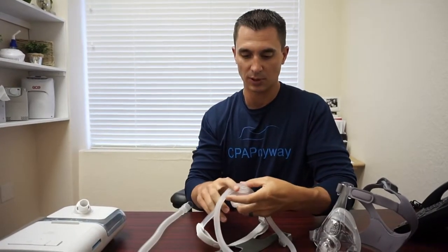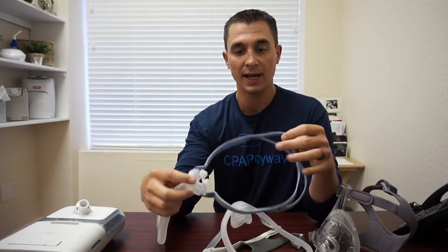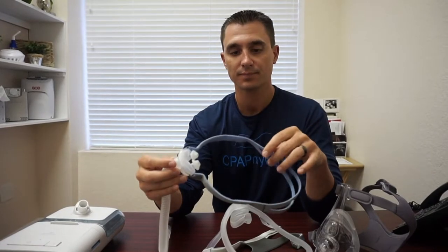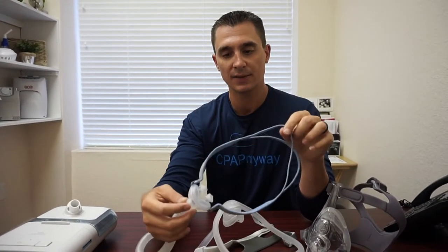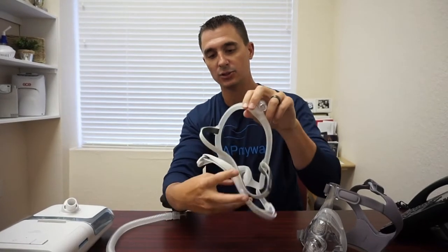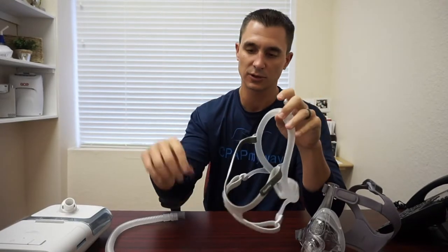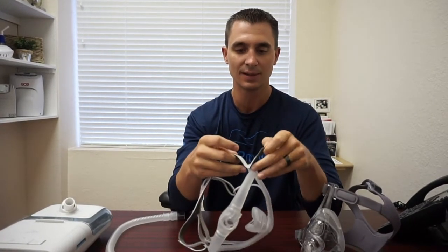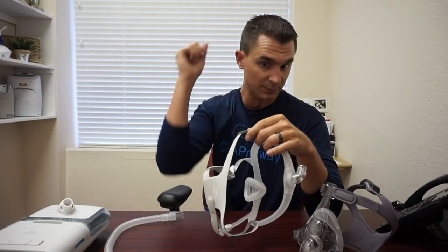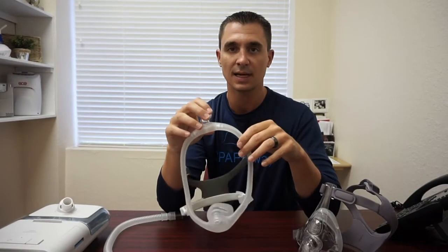One thing we glossed over on the P10 but is applicable to all of these is the headgear. The head straps on all of these are hand washable with a little detergent and water, and then air dried. It's recommended that you change your headgear — the straps, the material portion — about every six months to a year. You'll notice over time the Velcro, which is part of most of them, will get to where it doesn't stick as well, or the headgear will get so stretched that if it gets to that point, it's time to replace.